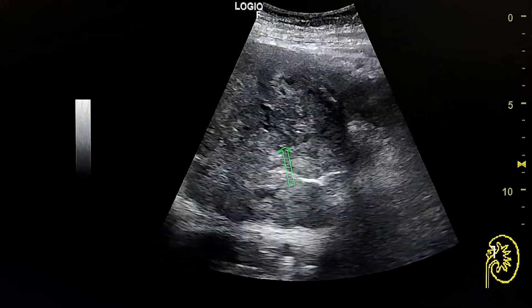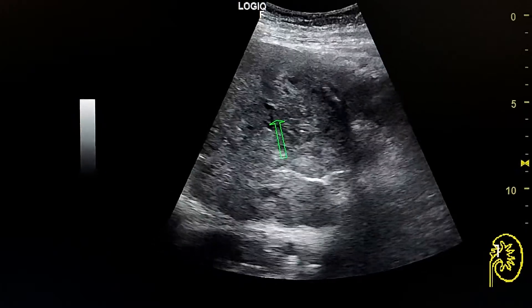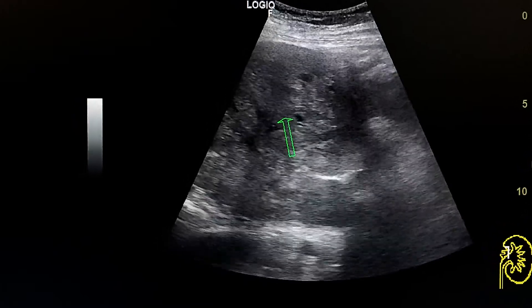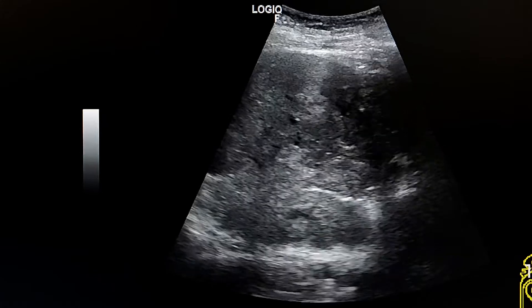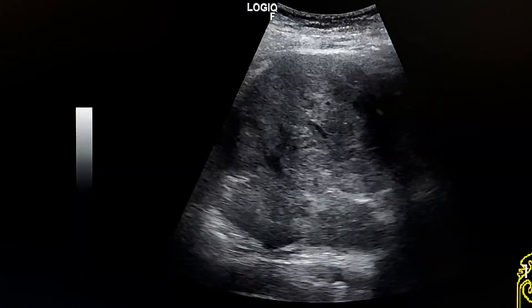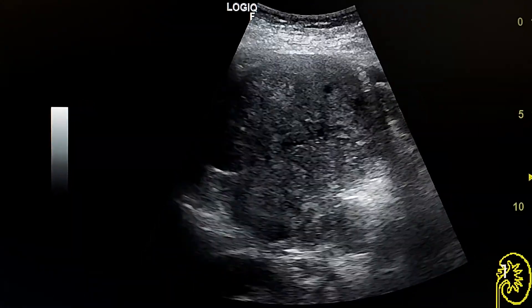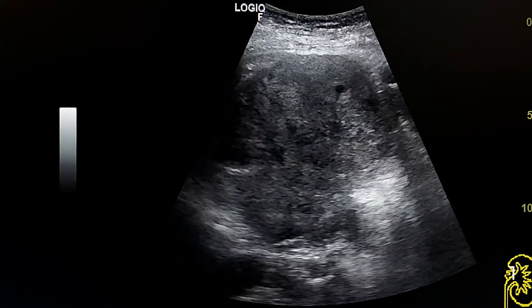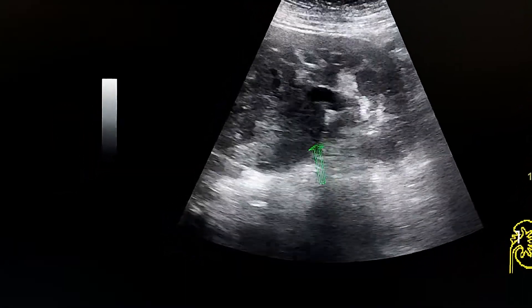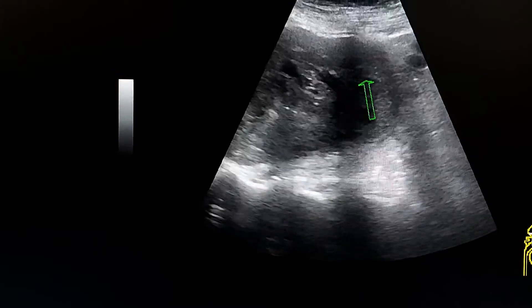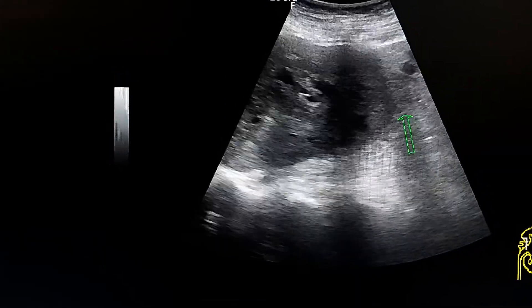It is heterogeneous with small cystic areas. This is the mass and this is the lower pole of the kidney.